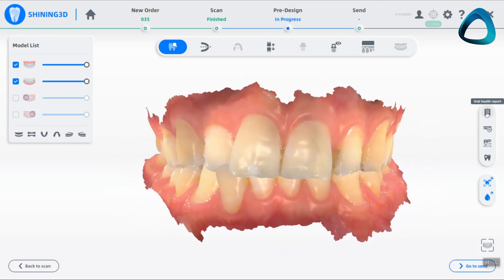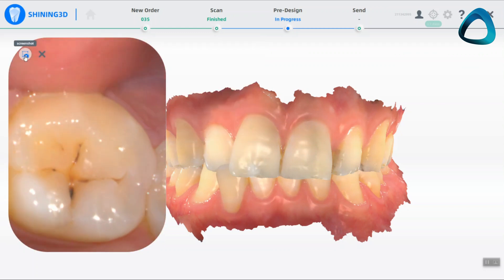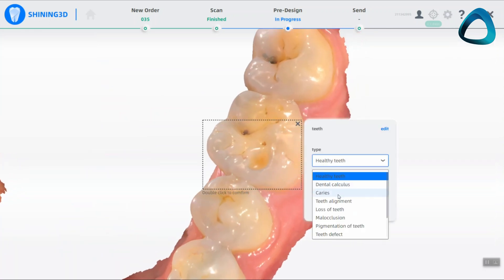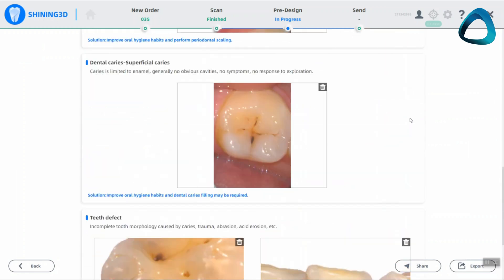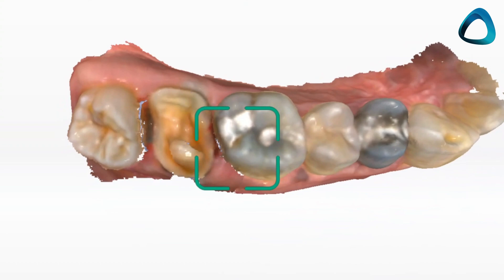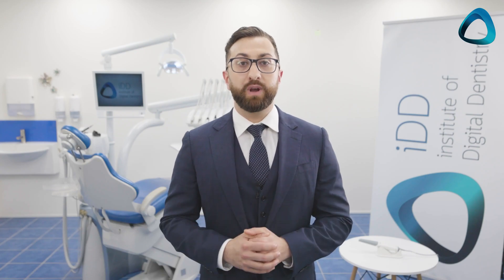Another interesting workflow that Shining3D has in their software is the Oral Health Report. You can access this by creating an 'other' or 'check' order type in your patient order form. This allows you or an assistant to use the scanner as a communication and diagnosis tool — you can scan the patient, identify key areas of concern, and generate a report to use when reviewing treatment plan options with the patient. The scanner can take intraoral photographs or highlight key areas on the scan itself, using a range of options for pathologies or issues, then generate an automated report. You can also use the original scan, change the order to a restoration type, and scan back in the prepared teeth. Shining3D is also one of the few intraoral scanner companies that also sell a 3D printer, making the integration and workflow even more effortless.